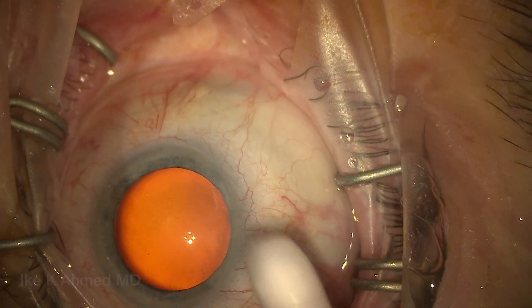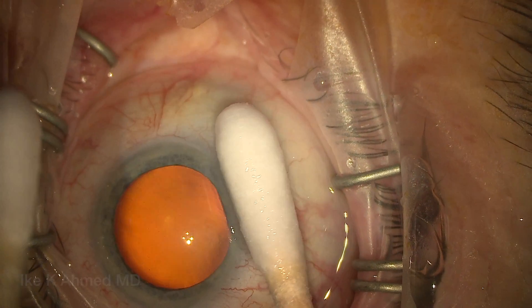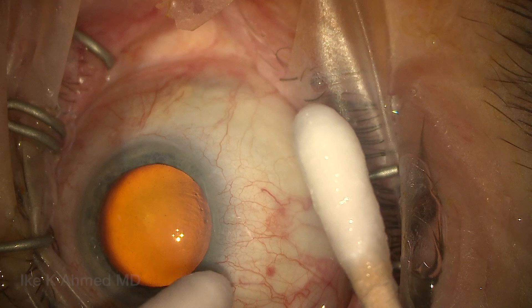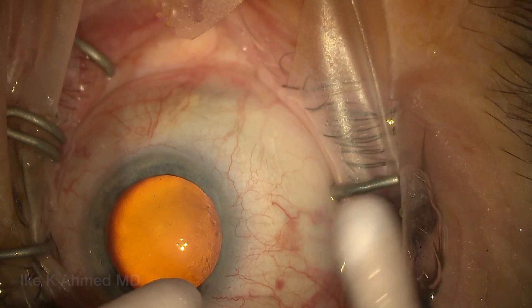The goal here, of course, is to create a more posterior bleb. The area of application is in the supranasal quadrant, which will be the area where the ZEN will be intended to be implanted. Having the patient look down again, rotating the Q-tips to keep the mitomycin away.